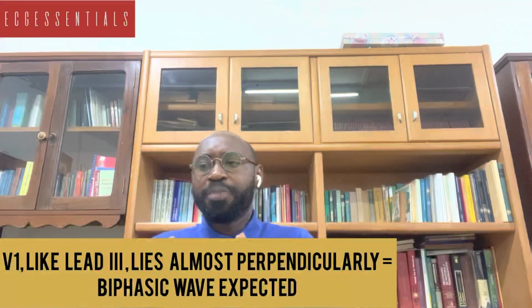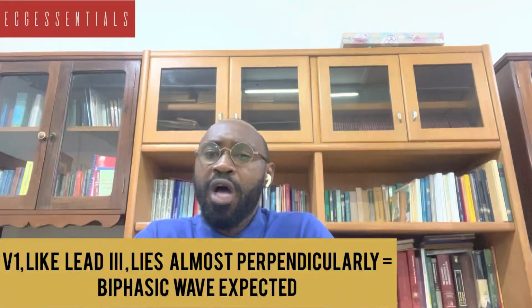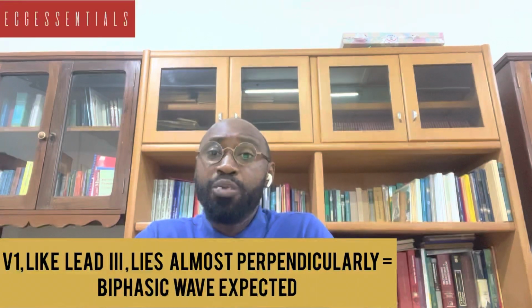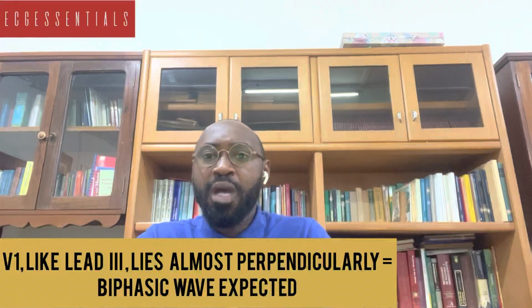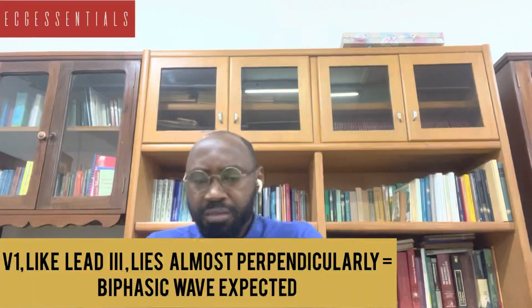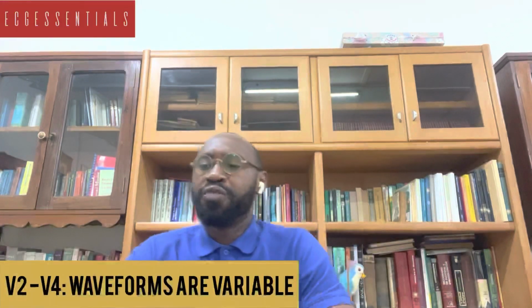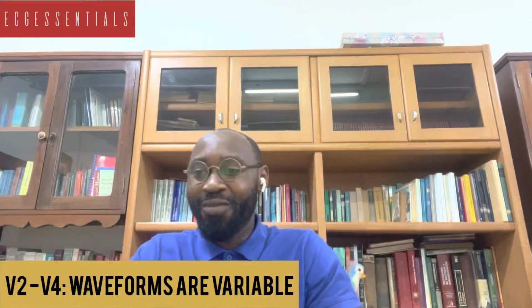Lead V1 lies almost perpendicularly to the direction of flow of the P wave overall vector of depolarization, and so V1 may also be expected to record a biphasic wave. From V2 to V4, the waveform may be variable.